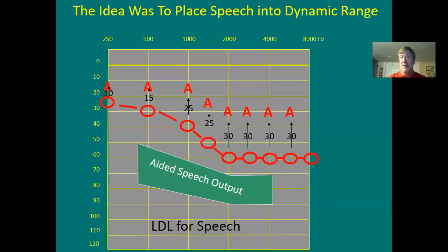That's kind of stupid. It's kind of subjective. We should have an actual readout with a research-based fitting method that's been proven to have good results for aided speech discrimination. And then that's the way we march forward as a healthcare profession into the public arena, so that we can raise the bar of our profession and show that we've got our act together.